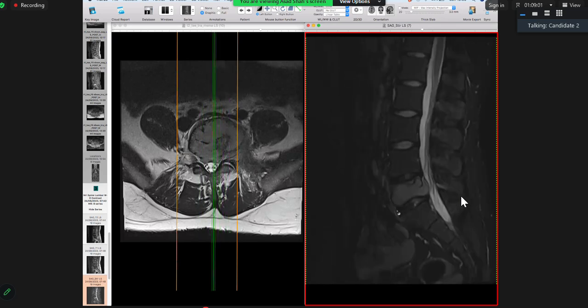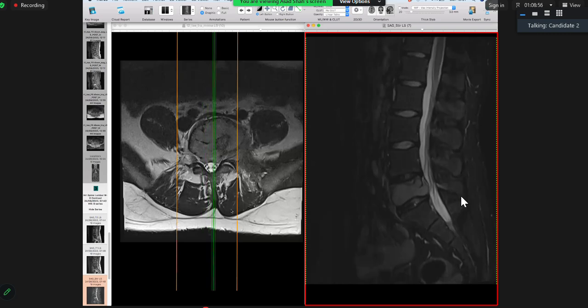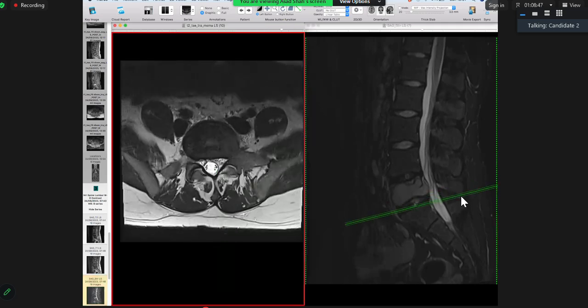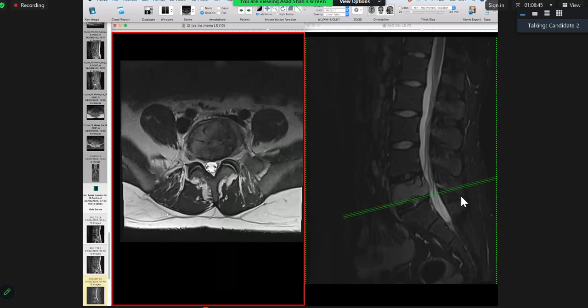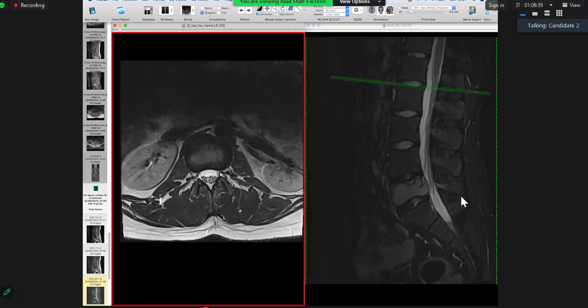First, I will urgently inform the referring physician about the finding to decompress this lesion and to relieve the patient from pain, as there is also mass effect on the lateral foramen and the exiting roots. Then I will suggest referral to the specialist sarcoma MDT. Also, I will suggest staging CT to look for a primary. I would also like to see the chest radiograph of this patient to rule out metastasis to the lungs.